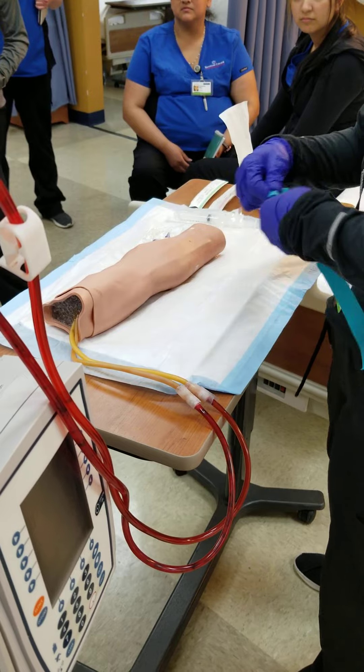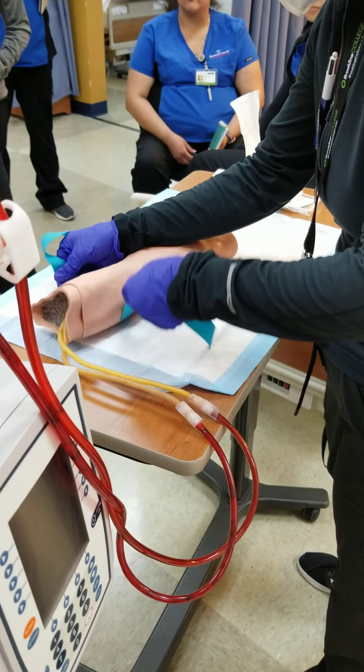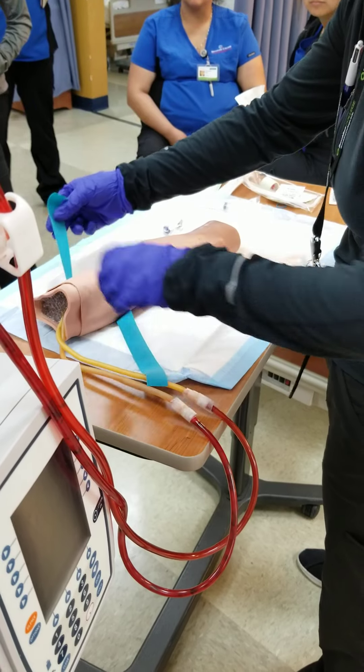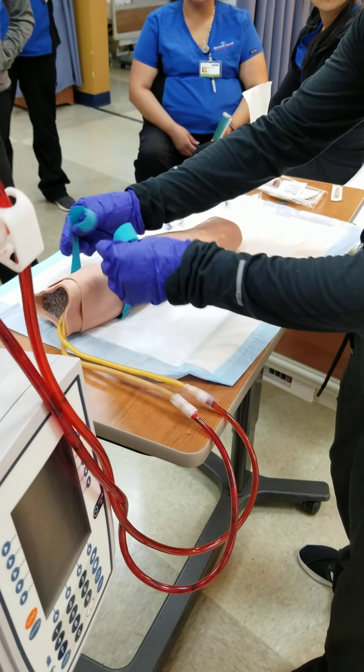All I'm doing is looking. What should it feel like? Bouncy. Yes. If we see it and do not feel it, there's not a good place to go, right? Because it's too far under the skin.